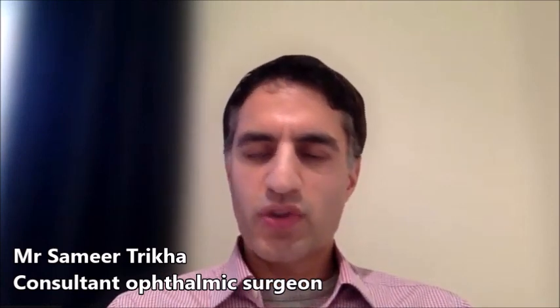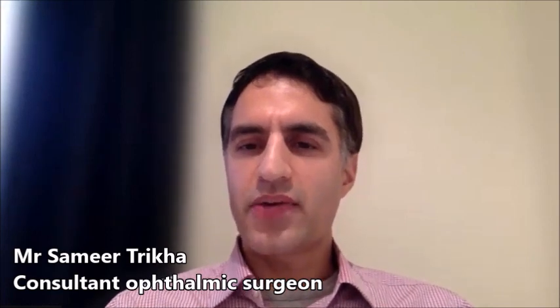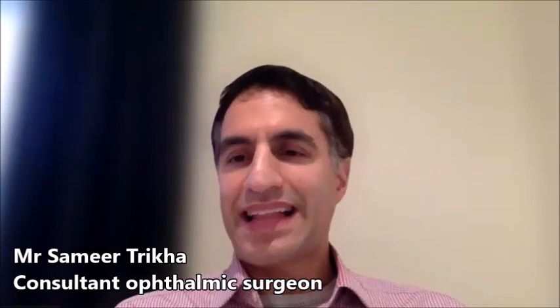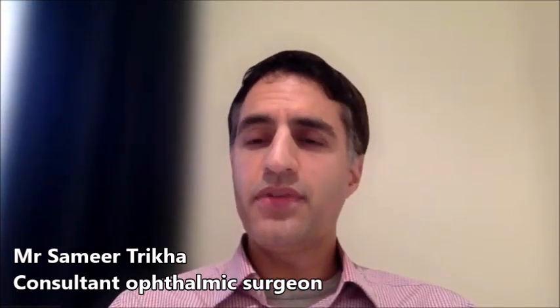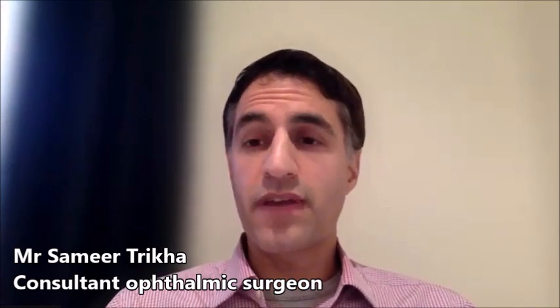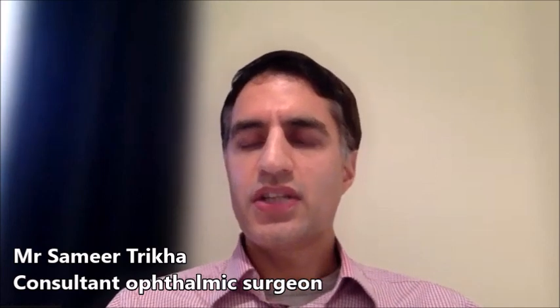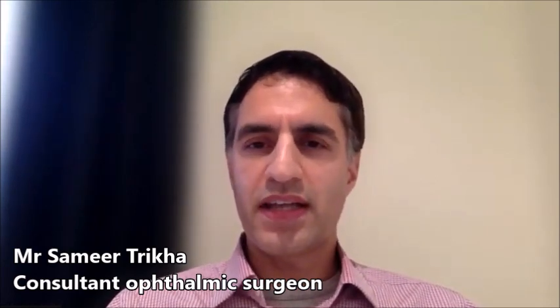And this morning I'm going to talk to you about types of lens options that we have available following cataract surgery. Now, when the natural cataract, which of course is clouding of the lens, is removed from the eye during cataract surgery, a number of different types of lens options are available. These are artificial lenses that can be inserted into the eye to give patients a desired prescription and, importantly, improve the vision in the eyes.